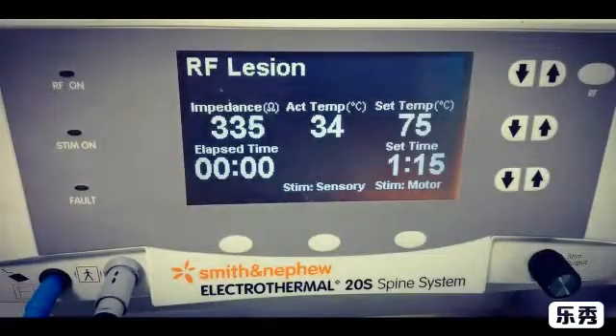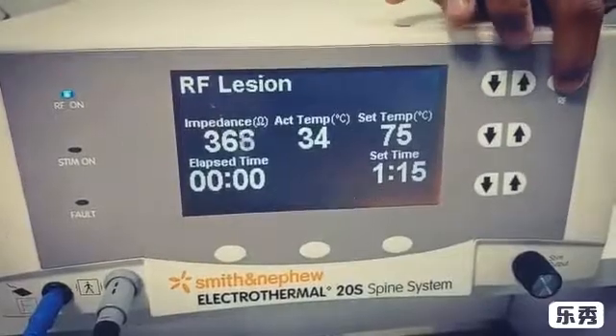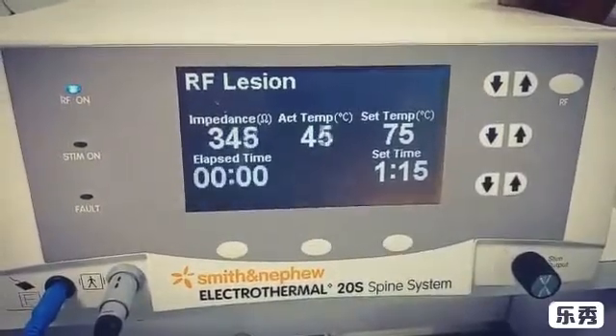Let's look at the RF machine. 335 is the impedance. 34 is the body temperature or needle tip temperature. 75 is the set temperature, and 75 seconds is the time. Once the needle tip temperature reaches the set temperature, the time count starts.